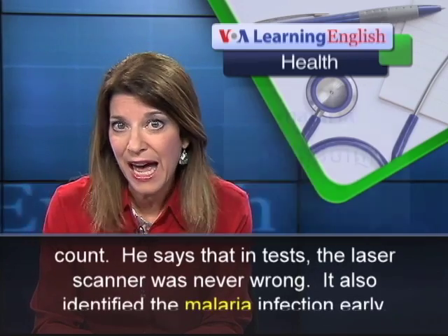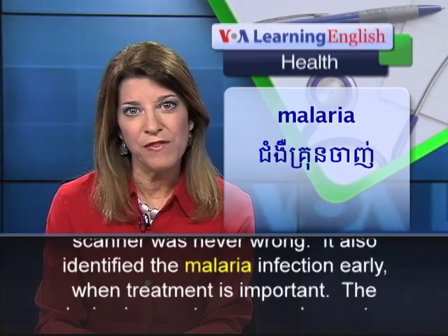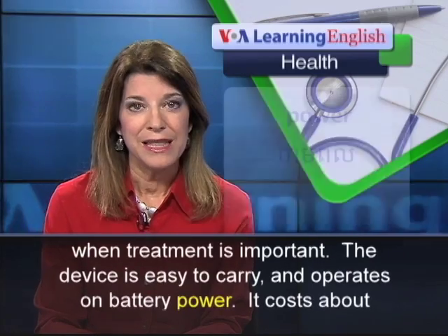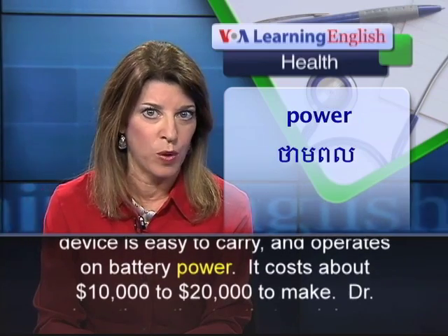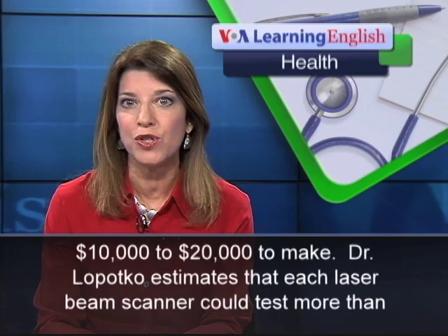He says that in tests, the laser scanner was never wrong. It also identified the malaria infection early, when treatment is important. The device is easy to carry and operates on battery power. It costs about $10,000 to $20,000 to make.